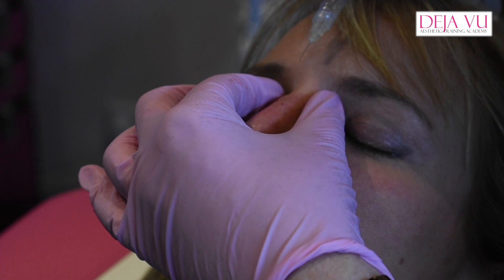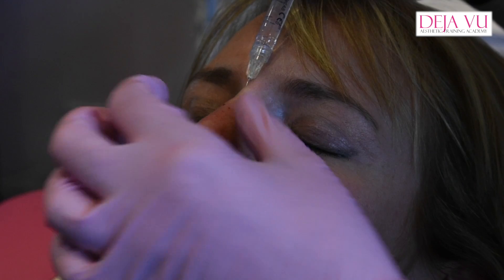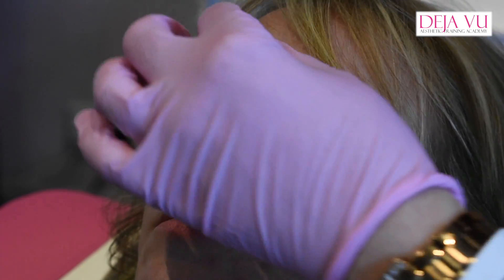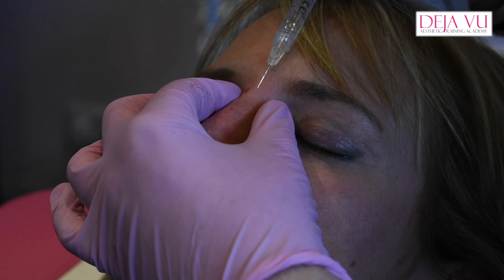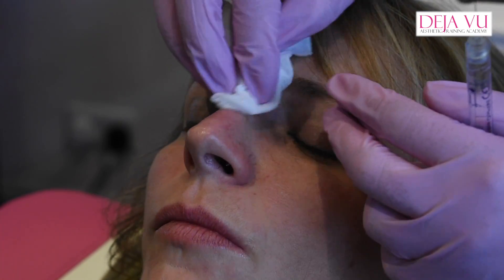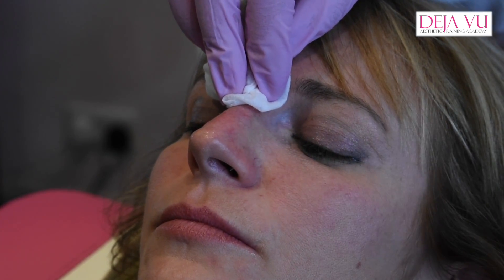It's looking pretty good already. I'm just going to soften it a little bit here. Do you have specific areas you have to be careful of when injecting the nose? The arteries — that's why you need to go really slowly. To use a cannula here, it's not specific enough. You need to be able to see what you're doing, and that's why I don't like using cannulas on the lips either. I can get a much better shape with a needle. With a cannula, you've got one long line and you can't really shape it so well.